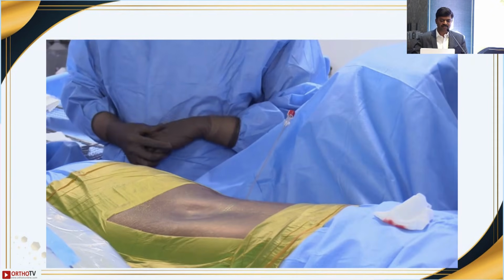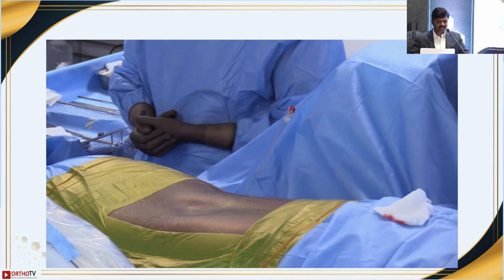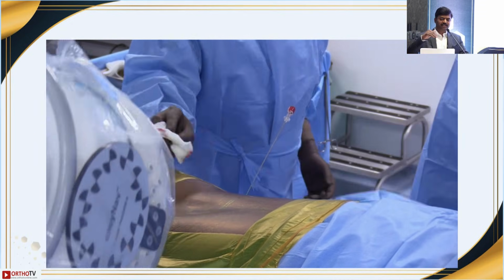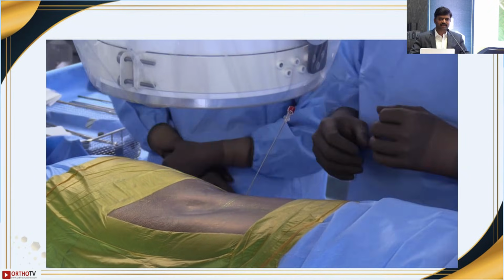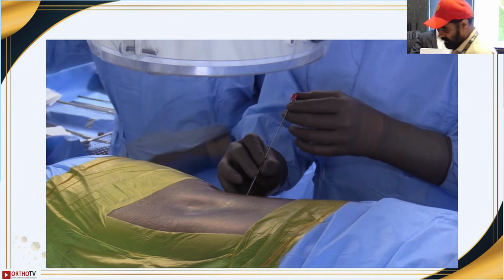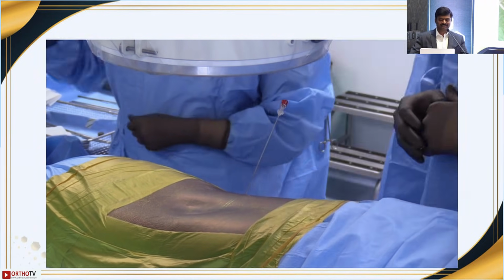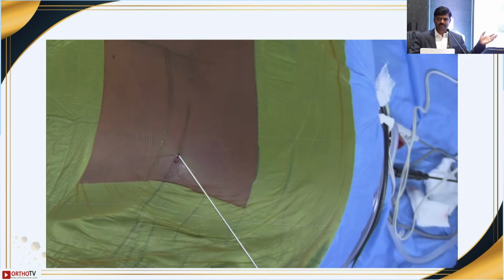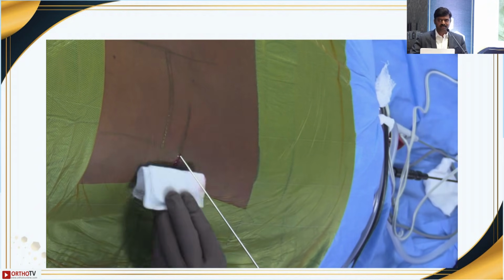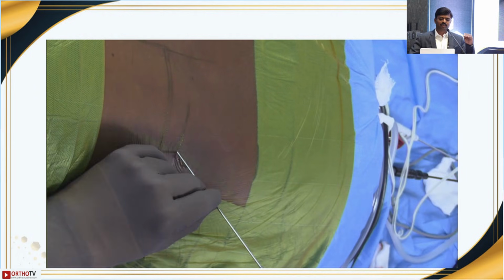Once you go there, because we are doing upper lumbar, the angle is steep here. Once I take a lateral view, here again there are two techniques: the inside out technique and the outside in technique. Dr. Datar is here, who is a proponent of the outside in technique. He has developed various techniques. You can follow either outside in or inside out, it doesn't matter, but you need to be there. Your angle needs to be crucial here because we are dealing with a central disc. We need to go to the opposite side also.